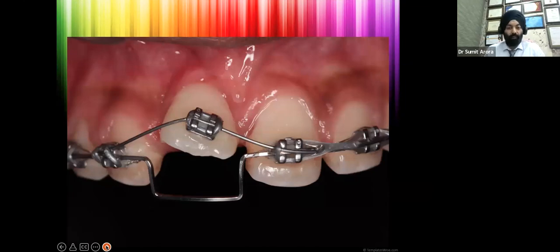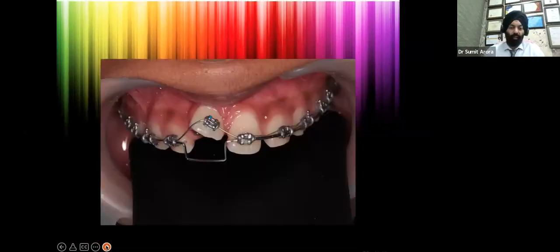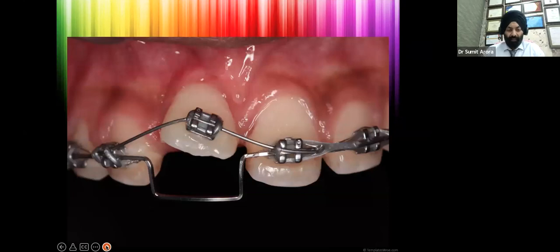We are focusing on the central incisor, that it is getting ortho treatment and coming into alignment. These small things make a big difference in your photograph. You can see from start to finish, the central incisors are there. Although it shows the picture is not taken in a day because the incisor position is changing, saliva we need to eliminate.